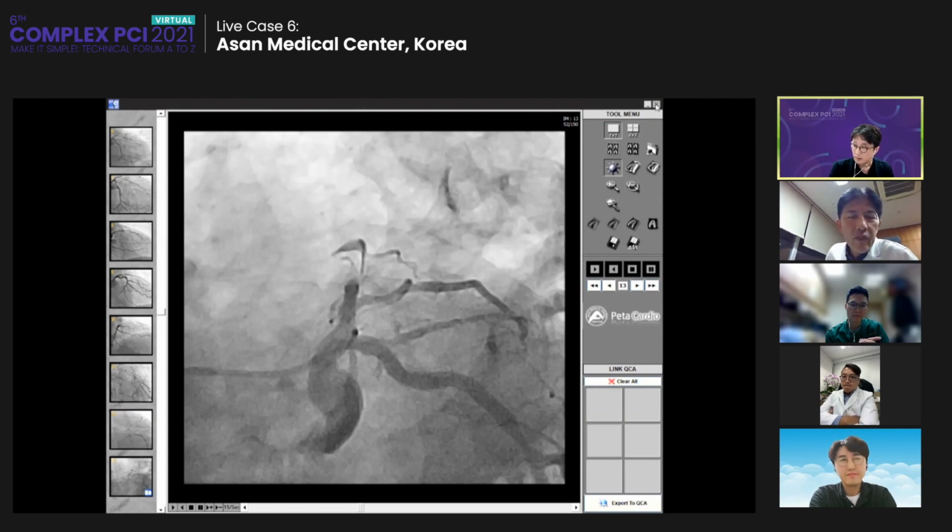And in our hospital's baseline angio, the connection to the distal LAD is not clearly delineated, but actually there was a good candidate for the retrograde approach connected to the distal LAD when we see the previous baseline angio from the other hospital, and we can see it a little bit later. Okay, we will go on.